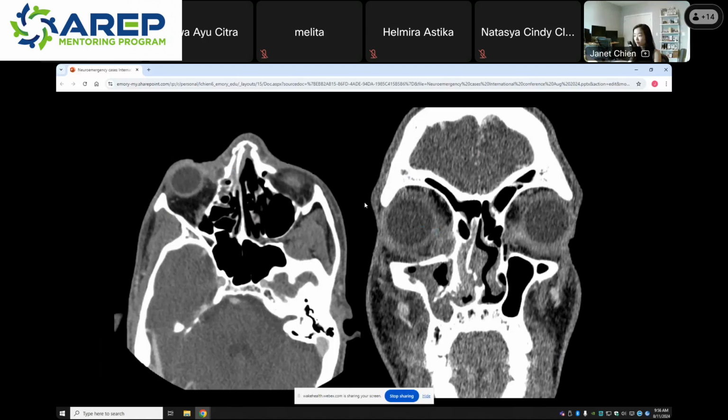Anyone? Medial canthus abscess. That's a really good thought. It's in that region, but there's a more specific thing that I'm looking for.